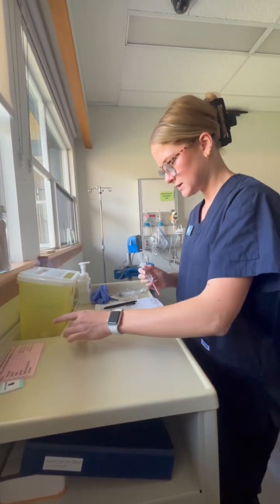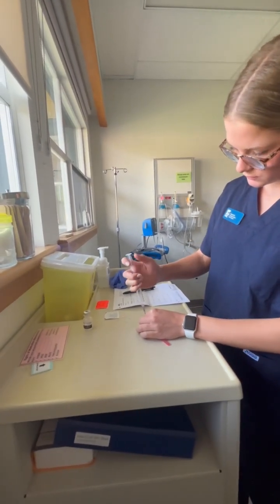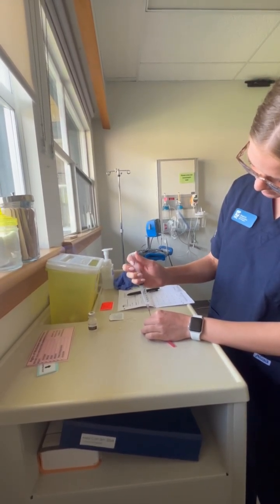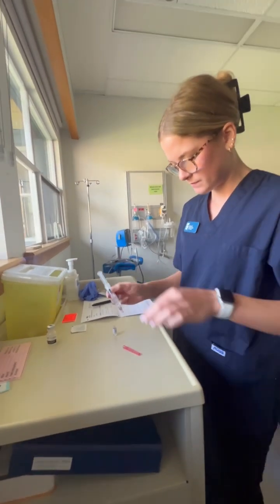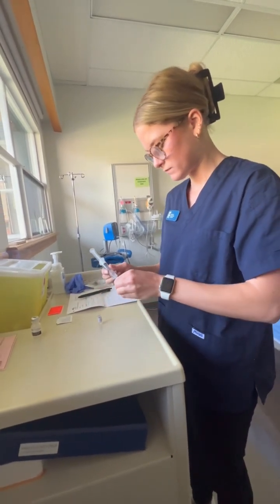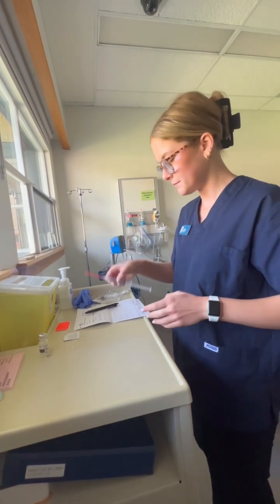All right. And I'm also going to draw up 1 ml of the medication, rather. Perfect. All right. Perfect. And I'm also just going to invert to mix the medication together.